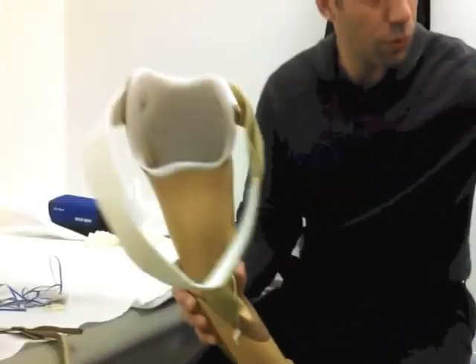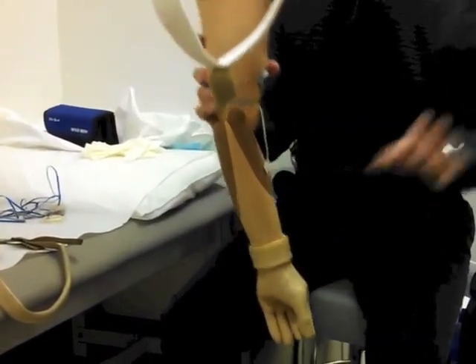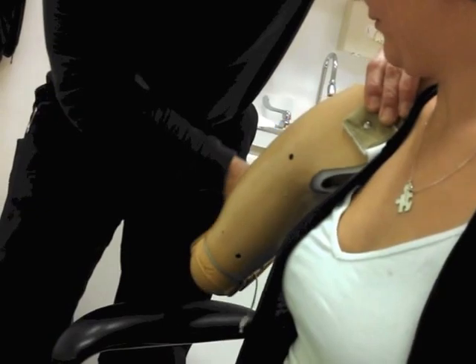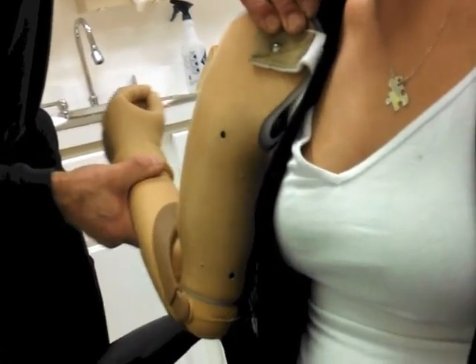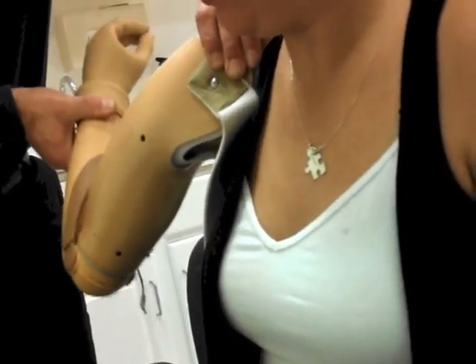When you put this on it's pulling it tight to you. Do you have that function, that movement? Yeah, you do. If I slide you in — this is the wrong side, but go ahead and bring your shoulder forward. You still have the motion. You can come back and come up — you still have that movement even with the strap on.